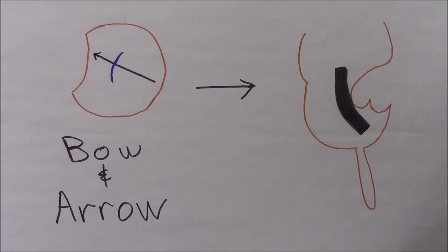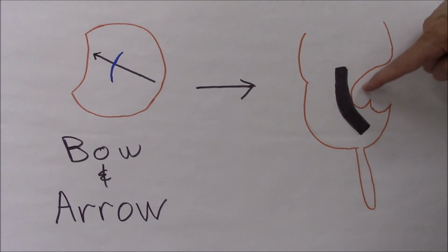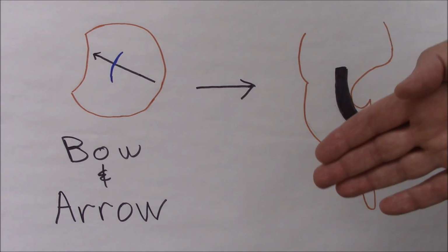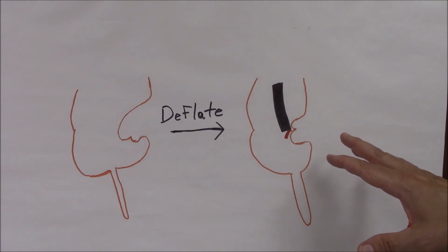The problem with this on a routine basis is that you spend a lot of time distal to the valve, sort of slowly coming back. So this is okay in a difficult situation, but it's not as efficient for routine use as the simple method of just deflating a bit, looking, finding the crevice between the valve lips, and driving straight into the TI. That should be tried first in almost every instance.